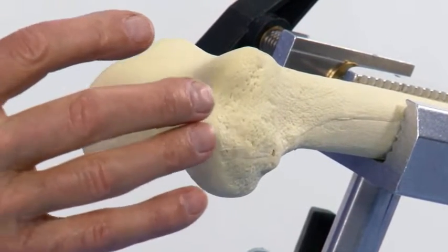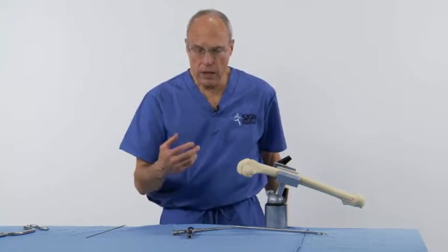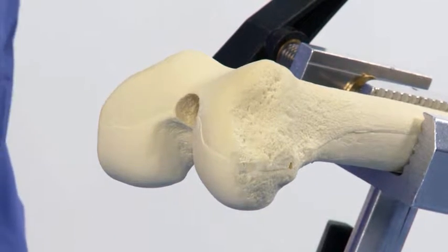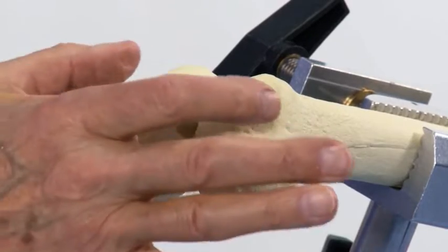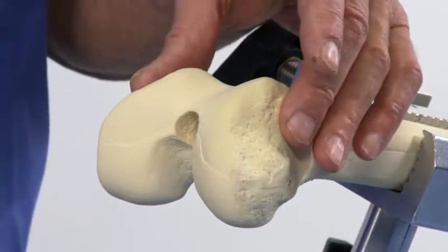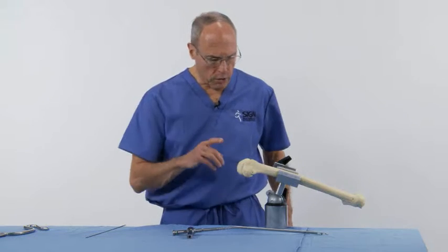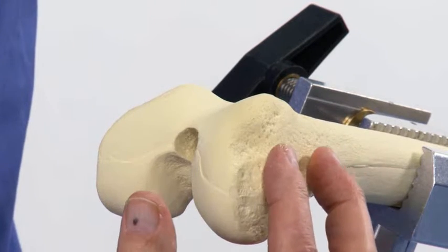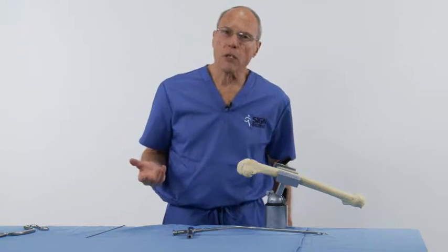You can then dislocate the patella laterally and easily reduce the intercondylar fracture. The same incision can be used to fixate the intercondylar fracture and place the nail. You can also use the same incision to place the interlocking screws through the end of the nail nearest to the knee.